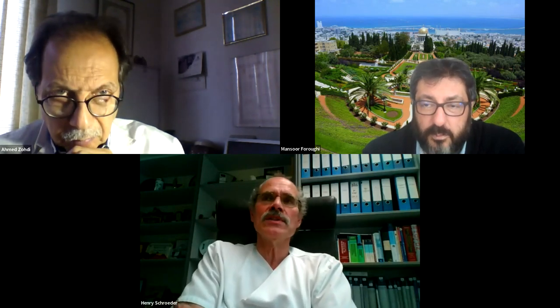Then I remove the endoscope and bring a tube in. The tube follows just the cortical puncture channel of my scope. And then I'm in the ventricle, and then with two hands, I can dissect. So I put a patty, I displace the fornix away from the vein and from the choroid fissure, and then I cut it. So I think it's much safer for the fornix. It's not that it cannot be done. You can do everything with an endoscope, but the outcome of the patient is what matters most. And we have to be very careful with fornix and veins.